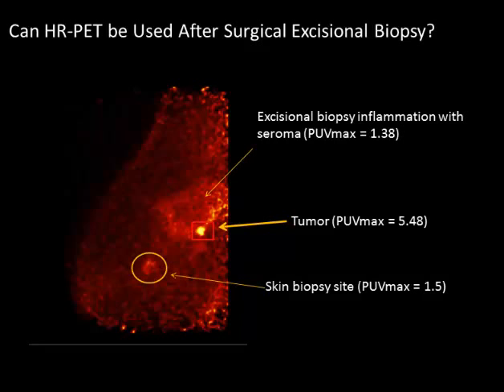This is a patient that underwent a stereotactic biopsy. They hit a little vessel and she had a massive bleed, so they had to withdraw. The lesion they went after was still inside, so she went to an excisional biopsy 7 days later.